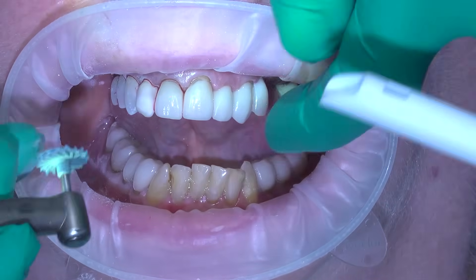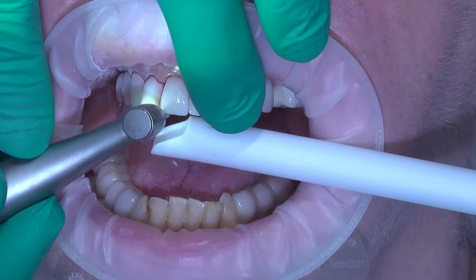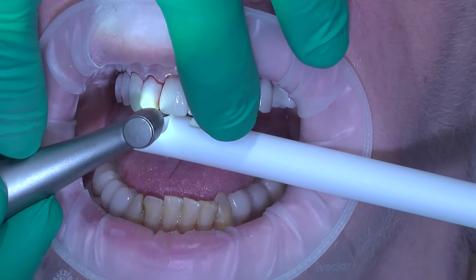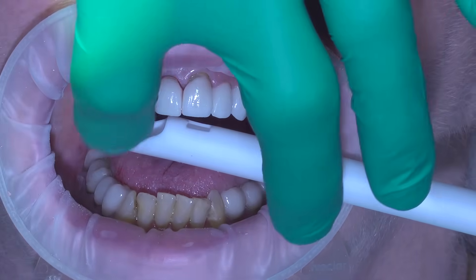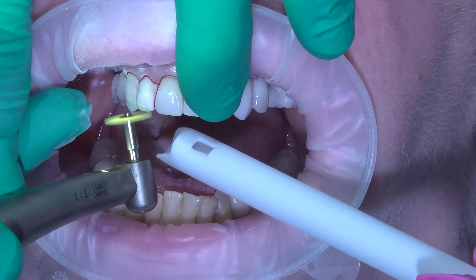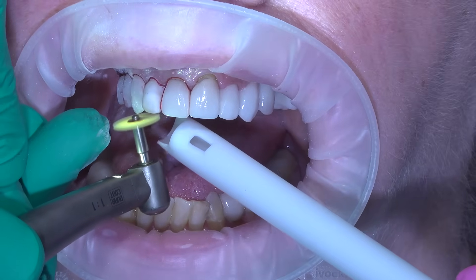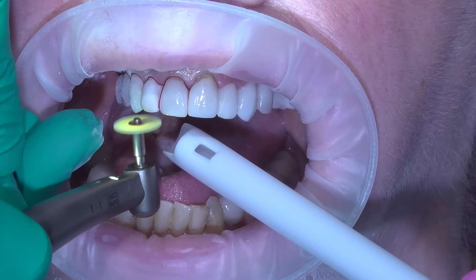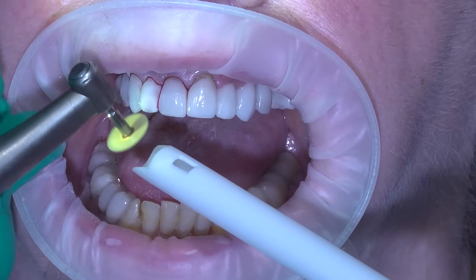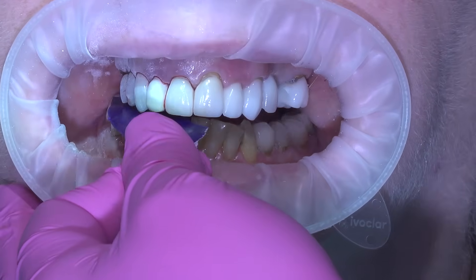As long as it's kind of holding the space, it's doing its job — so I typically don't work too hard at this. Let's try to fix that incisal edge, and immediately it starts to look a little better. Notice how very little bleeding we have in the surgical field, and it's only been a few minutes. Now this is one of my favorite tools — the soft flex discs. I really have a lot of artistic control over how my provisionals look when I use these soft flex discs. It's also a good idea when using discs to have an instrument at the other end to protect the lips and keep them out of the way — it keeps the patient from inadvertently asking you a question while you're working with a high-speed rotary instrument.